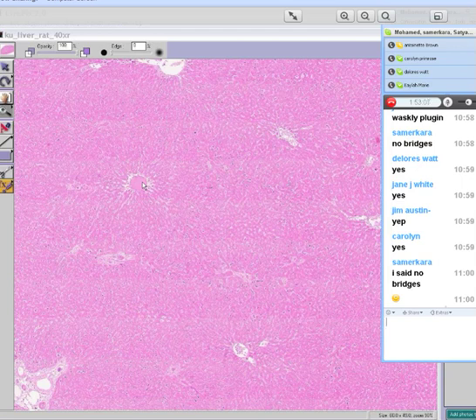And you generally have to see that the central veins are kind of regularly interspersed with the portal veins. Now, if you remember, I said about 10 times, I called it a hexagonal architecture, and that's the word pathologists use. All that means is regular. In reality, you'll never really see true hexagons like you see in the textbooks. But just remember, you have to have sort of a regular interval between the central veins and the portal veins.